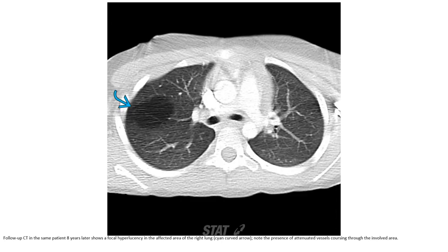Follow-up CT in the same patient at an older age shows a focal hyperlucency in the affected area of the right lung. Note the presence of attenuated vessels coursing through the involved area.